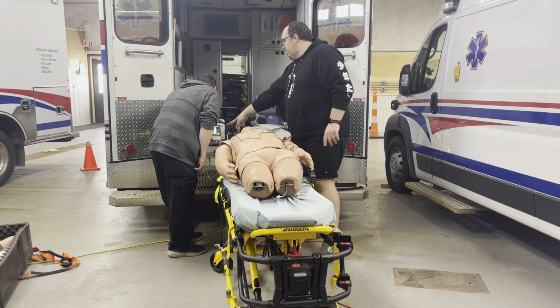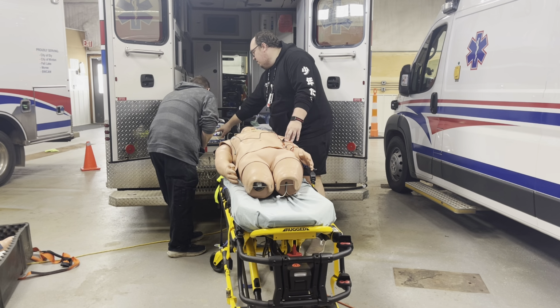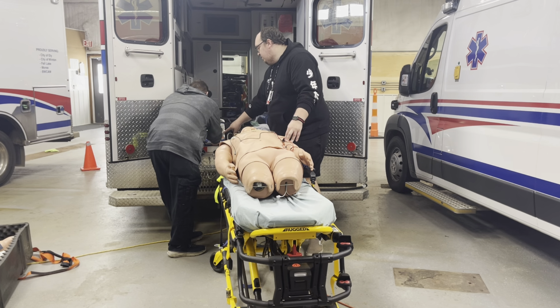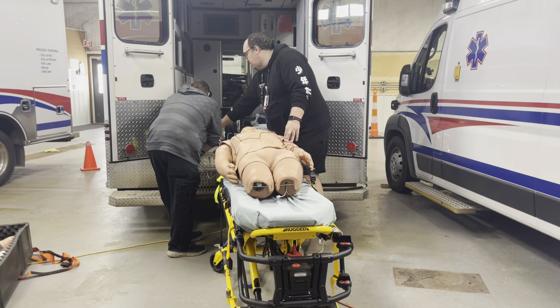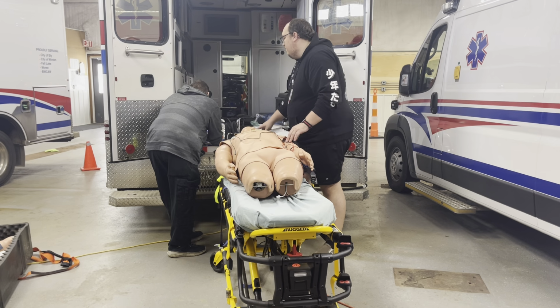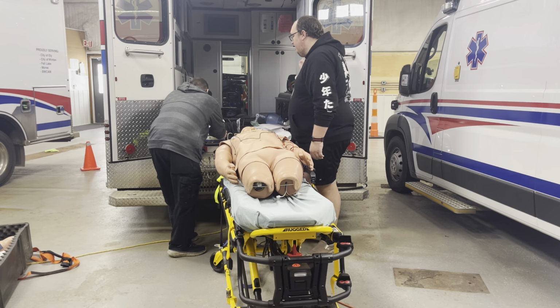Our pacer button is the green one. And then in order to use ours, we want the rate to be at 70 and we want it to be demand. The output you're going to change, but if you change this now, you're not going to see anything on the monitor. You need to start pacer and then go up to your output. This one. And then this will start printing, but we're going to stop that, otherwise it's going to run out. And then now you need to change your output so that the pacer is connecting with the rhythm.